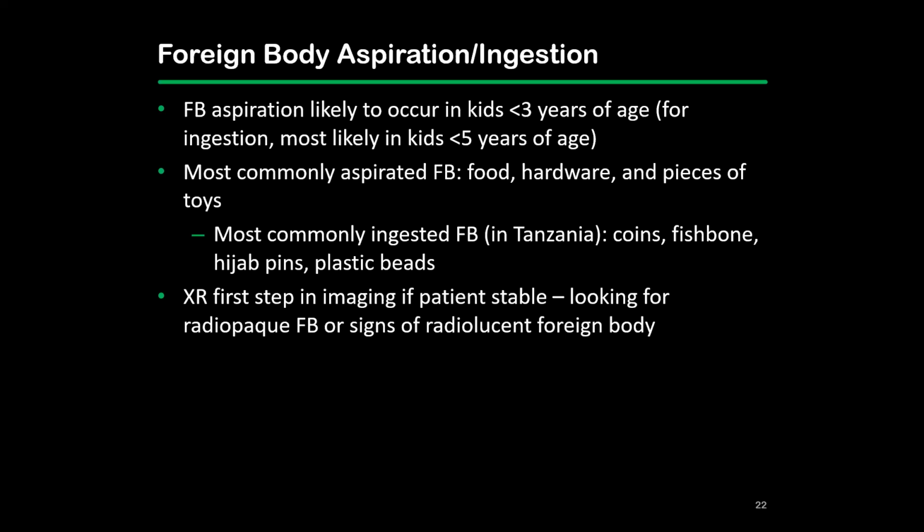The first step in foreign body aspiration, if the patient's stable, is to go ahead and do an X-ray. You're looking for either a radiopaque foreign body that you can quickly identify or signs of a radiolucent foreign body.